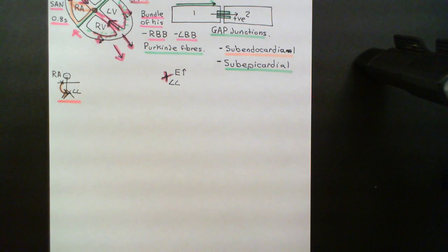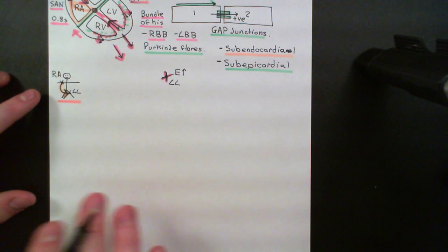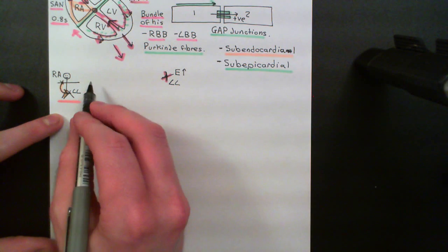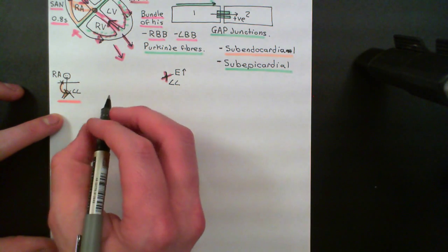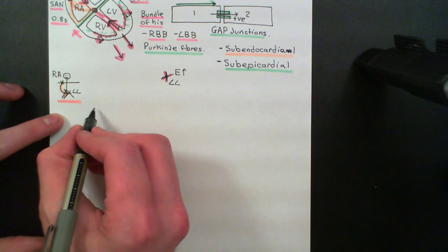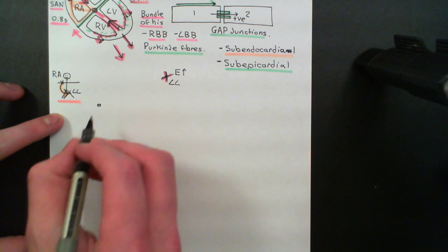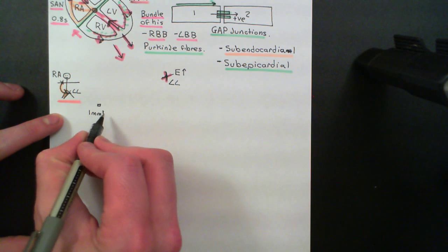Okay, the next thing I want to explain is ECG paper. What are the units for ECG paper? This graph is going to be drawn on special paper known as ECG paper, and of course we're going to have time along the x-axis and electrical potential difference in millivolts along the y-axis. However, I need to explain the type of paper it's drawn on. It's paper with loads of tiny little boxes, and the little boxes are 1 millimeter by 1 millimeter, so they'll be this sort of size here. So, 1 millimeter square paper.